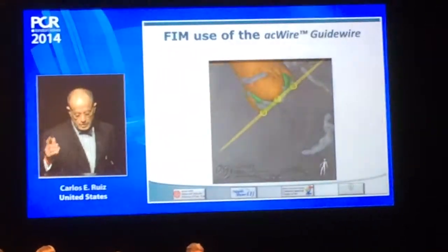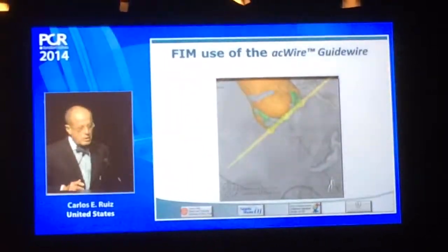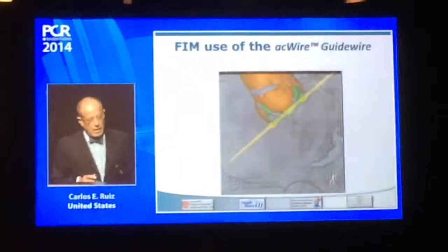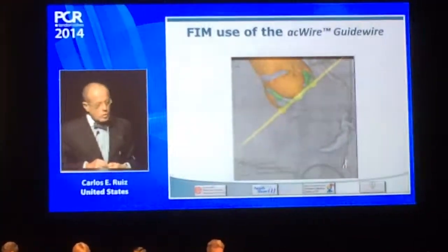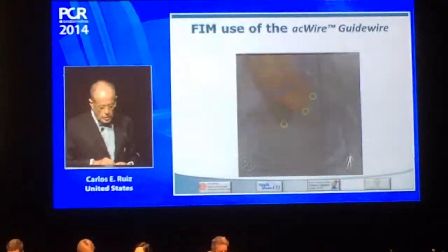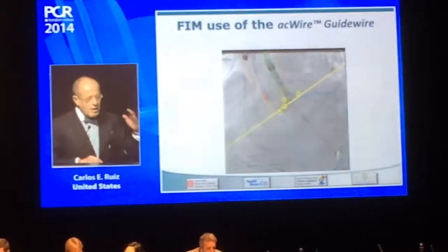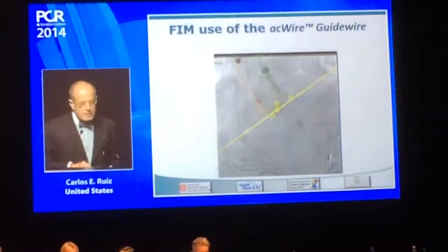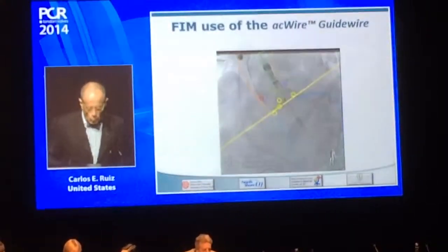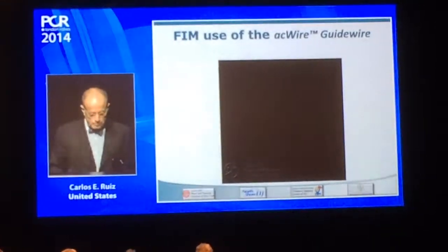We've done just a handful of patients, but we found that correlating this wire with the fusion imaging technology, there was an excellent correlation. And basically, when you see those 3 dots of markers of the wire aligned at the commissures by pulling, they correlate incredibly well with the pre-planned angulation for the plane of deployment.